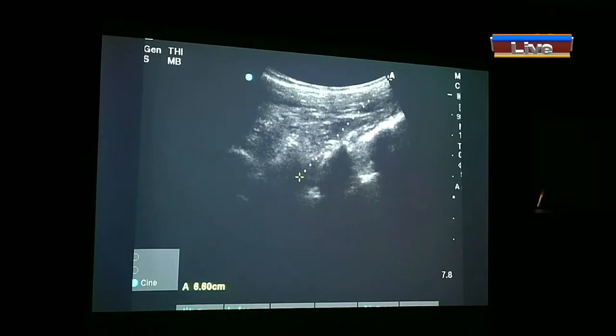So, are you understanding? There are lots of things which you can do. There's no limit to it. If there's an obese patient, you can calculate. You can find and locate and mark the space before the procedure. So how do you start doing chronic pain procedures is nothing. Why are anesthesiologists best at it? Because we are already doing most of the stuff anyways. So you can easily do this. This is not impossible. Okay.